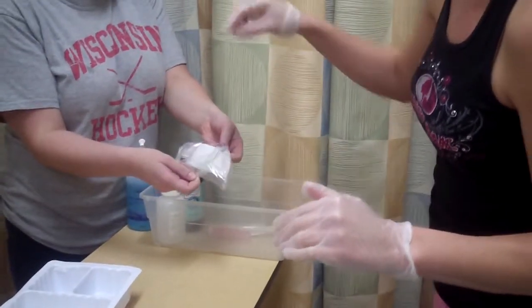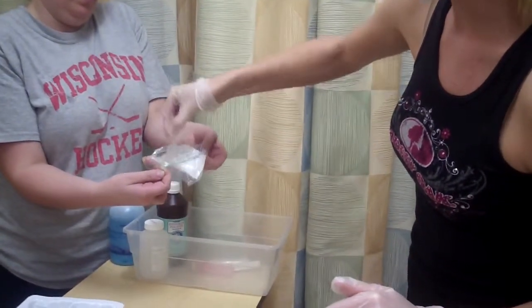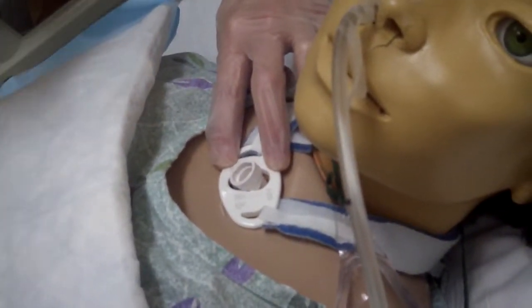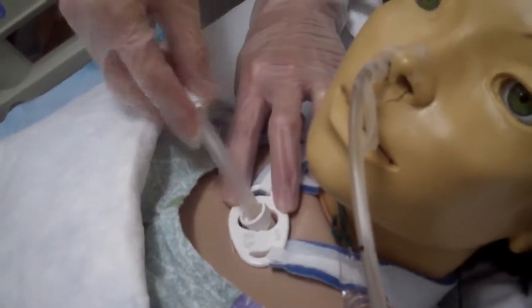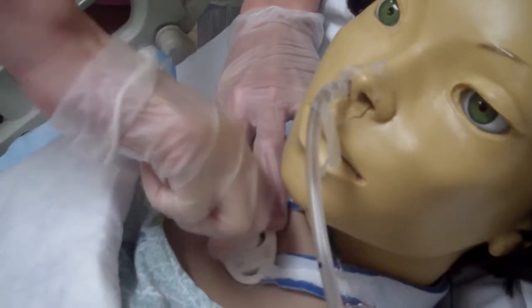I'm going to reach inside and pull it out with my sterile dominant hand. Being careful not to contaminate it. Thank you, Lisa. I'm going to bring it over here and with my left hand hold down the faceplate and with my right hand insert the new cannula. Lock it into place.